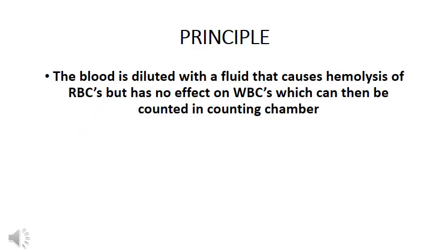Here is the basic principle of the total leukocyte count. The blood is diluted with a fluid that causes hemolysis of RBCs but has no effect on WBCs, which can then be counted in a counting chamber. So this is the basic principle.